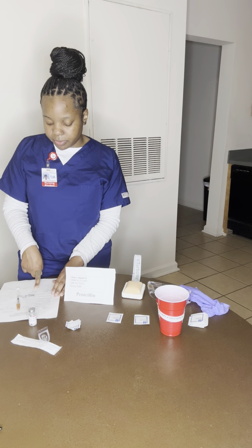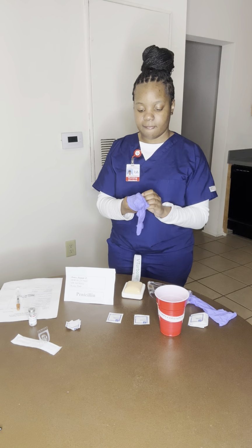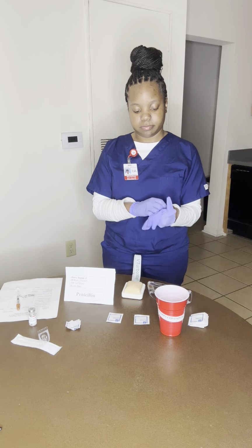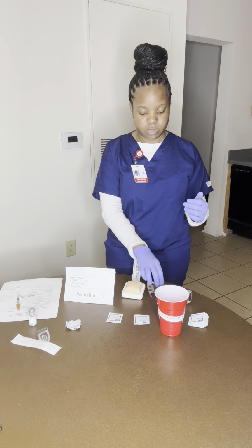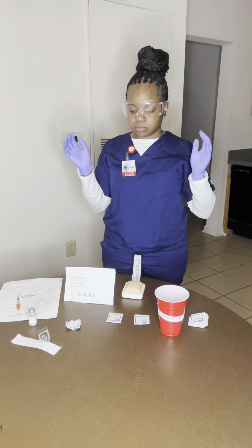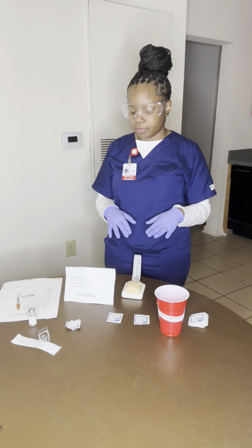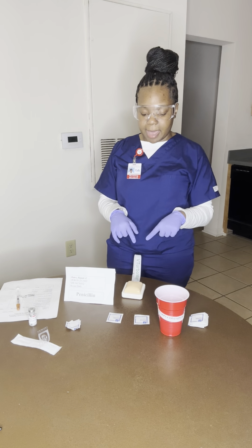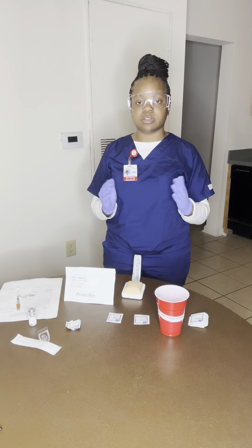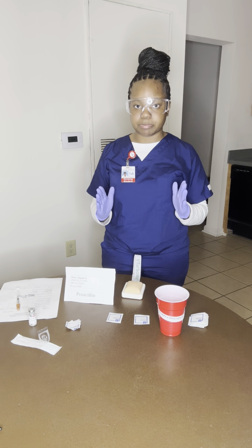So now I am going to put on my gloves. My goggles. And I am going to describe the location. With heparin, we would give the shot in the abdomen, 2 inches around the umbilicus, and we wouldn't go above the costal margins or below the pubic area, and we wouldn't go past the anterior superior iliac spine.